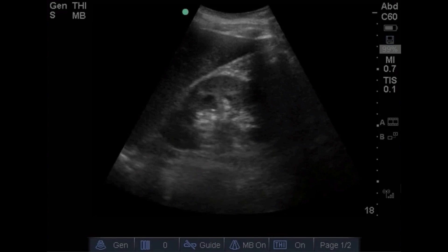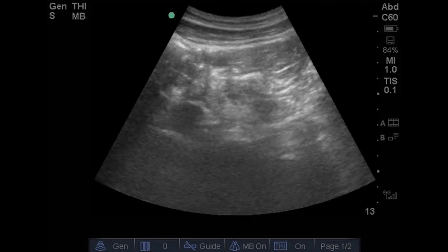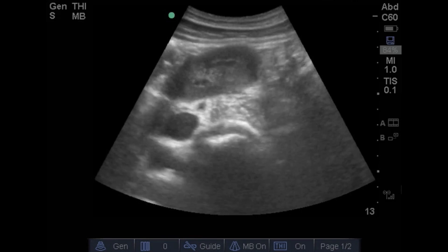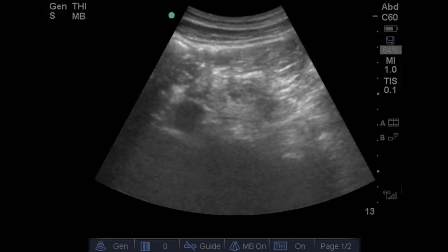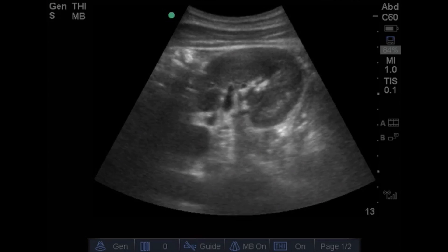Pay particular attention to the pelvis and collecting system. Here you can see an image of the renal pelvis and collecting system without dilation. Our next view is imaging the kidney in a transverse plane with the indicator pointed anteriorly. As we scan through the kidney we'll see it in a transverse plane — again making sure to image through the renal pelvis to see the collecting system. Here you can see the renal pelvis, kidney in transverse plane, renal parenchyma, and collecting system.